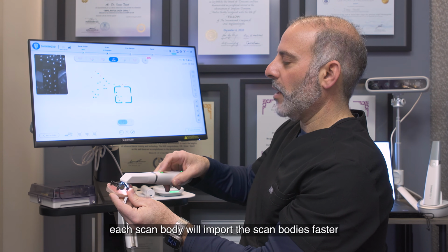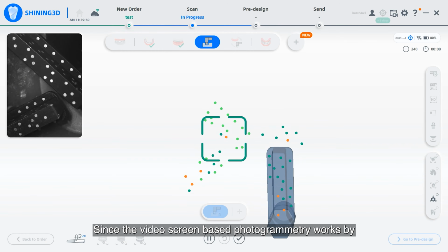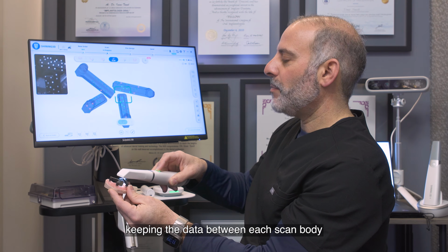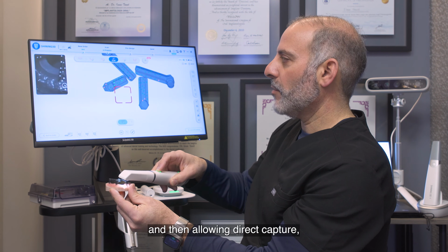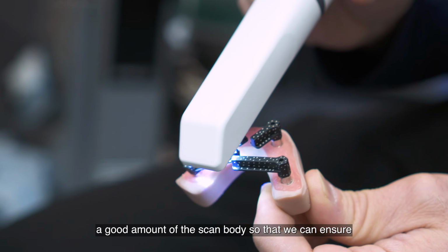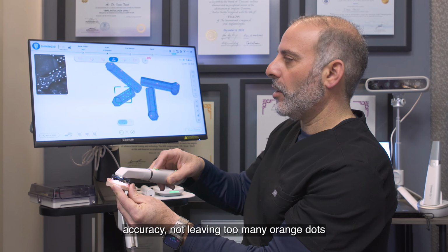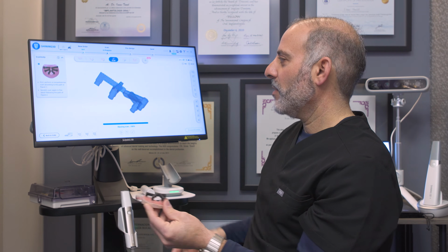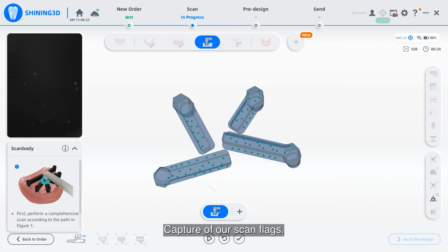Centering over each Scanbody will import the Scanbodies faster and with more accuracy, since the video stream-based photogrammetry works by keeping the data between each Scanbody and then allowing direct capture. It's important to capture a good amount of the Scanbody so that we can ensure accuracy, not leaving too many orange dots and having much more green dots. Now showing high accuracy capture of our scan flags.